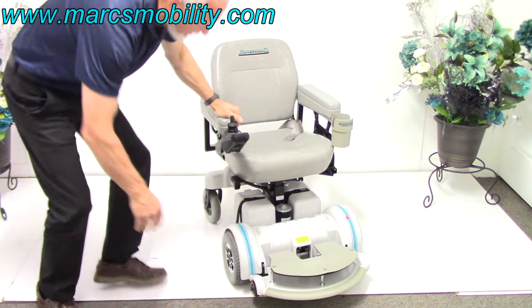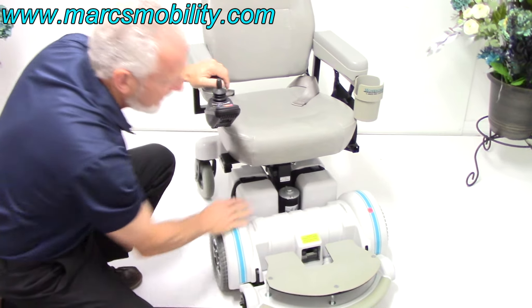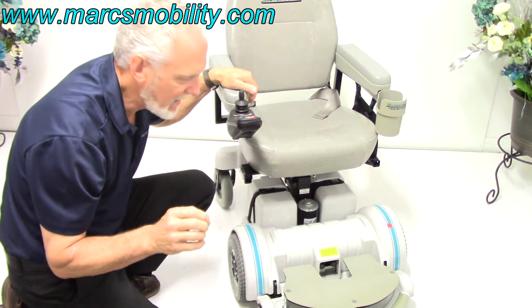You can see right here, the motor for the seat lift is right here. You have two batteries, one on each side. These are U1 batteries, which will give you about 15 miles on a battery charge.